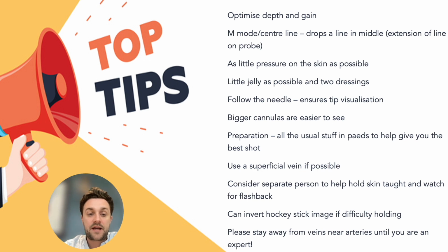Hockey stick probes can be used as well, and you can invert the image, as sometimes where the pointer is, it can make it quite tricky to hold, but you can flip the image if you know how to do that in your settings. In particular, please stay away from veins that are near arteries until you're an expert.